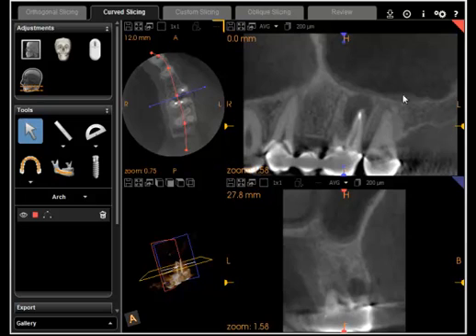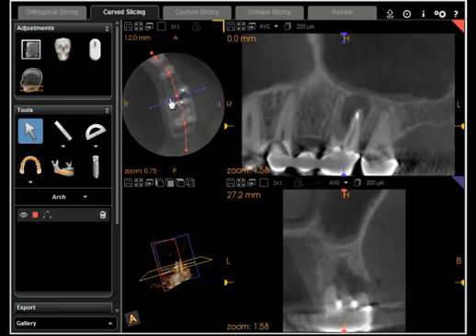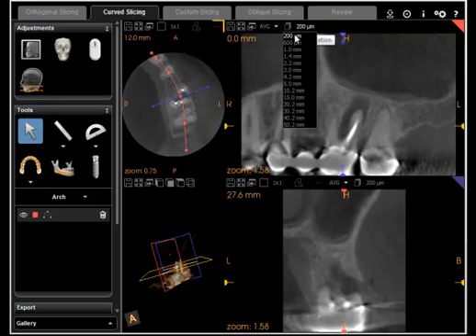What this has now done is create a curved slice. If the anatomy doesn't match up exactly to what you want to see, any place where you have clicked you can move that curve to adjust the curved slice. And again, as we did before, we can thicken that slice.